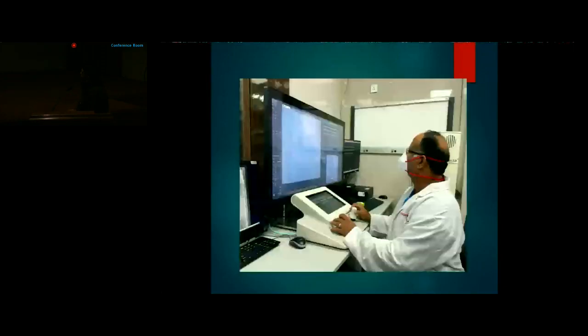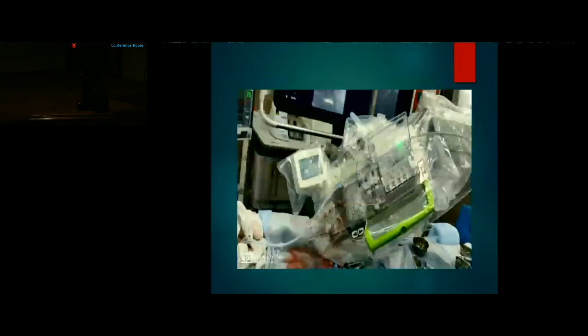and which consists of an interventional cockpit. This is the cockpit which is placed in the console away from the radiation, which has multiple joysticks which help in the precise movement of the coronary wires, guides, and precise deployment of the stent. This is the cassette which we use in the robotic PCI, in which coronary wires are loaded along with the guide, and which is controlled by the joysticks outside in the console. And one operator also stands here near the patient.